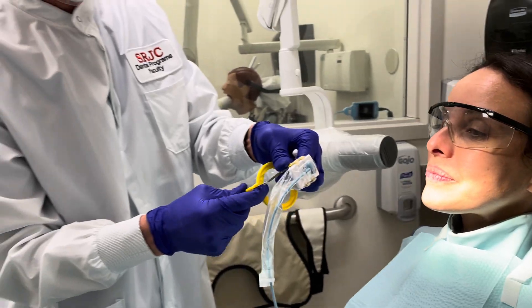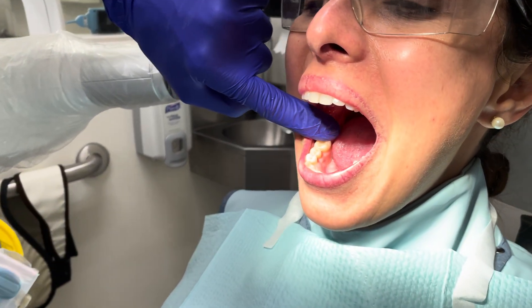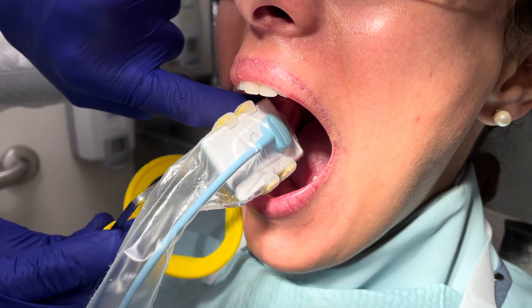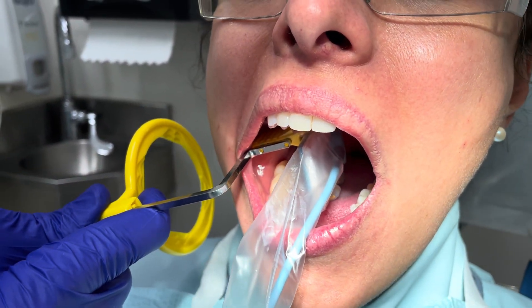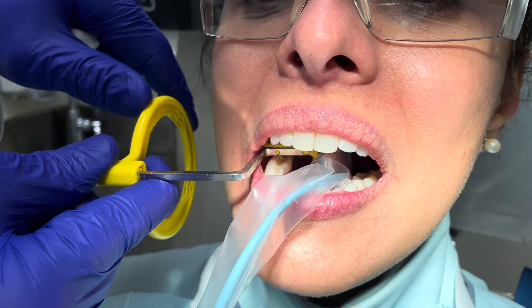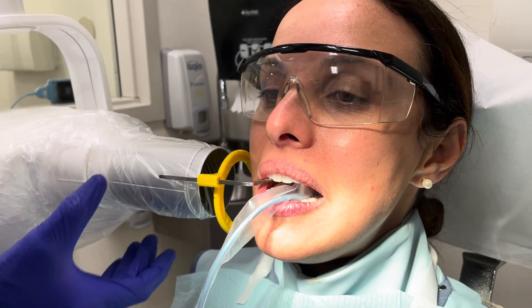The last one I'm going to do — mandibular molar. Same thing. When I have my bite block, I should be able to see all that front portion of the tooth there. Getting back into the mouth, pulling on the cheek — I can usually pull a lot on the cheek. There's a lot of flex there and she's not going to feel that. Getting it down against the molar. Slowly bite into place. Bring that ring in. Line up. And image. Open please.